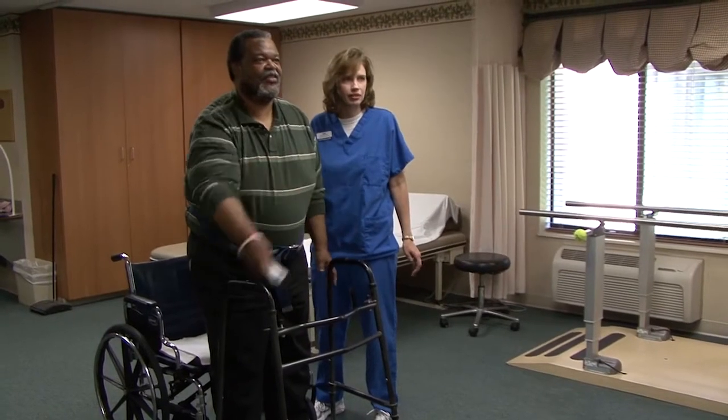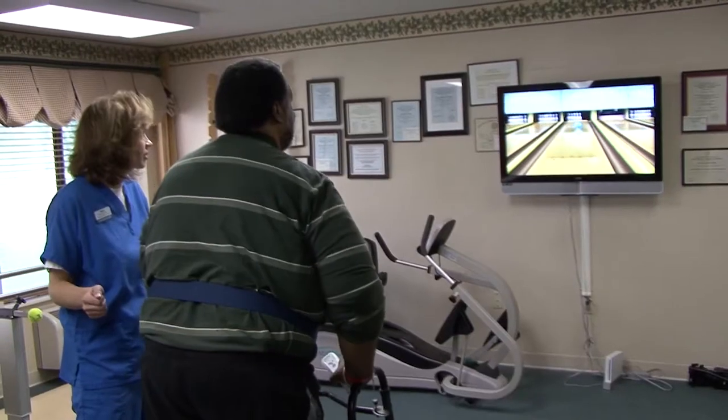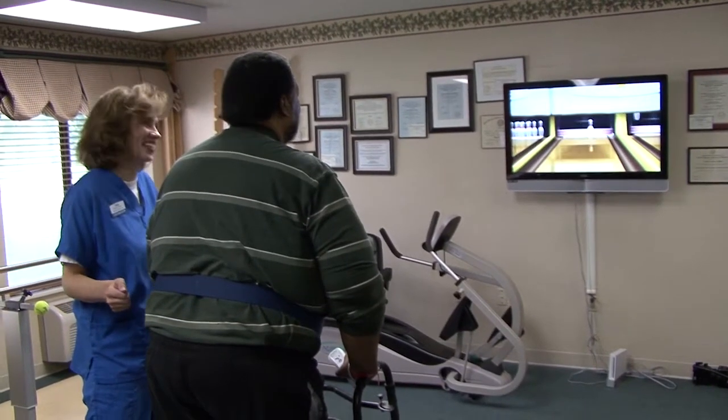A lot of times we'll use the Wii bowling because we're using it for balance, for reaching beyond a person's center of gravity. This helps a lot as far as assessing a patient where they're at at this time.